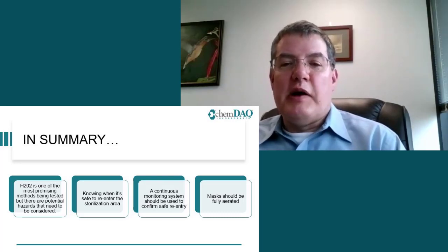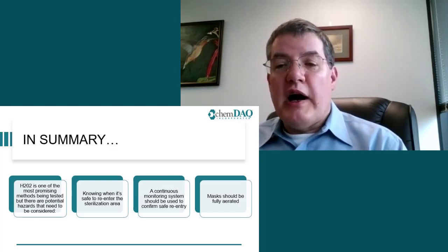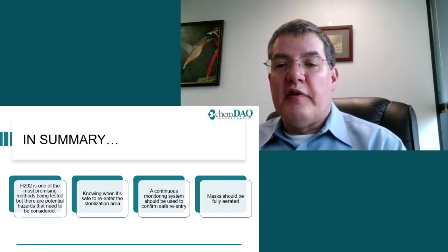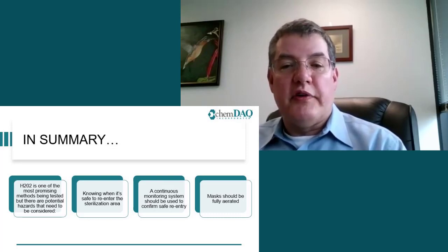Using hydrogen peroxide, however, poses risk for both methods, but especially for room disinfection. Hydrogen peroxide is, of course, toxic and has no smell. How does one know when it is safe to re-enter a room? The answer is to use a portable gas monitor for hydrogen peroxide. Similarly, residual hydrogen peroxide in the mask present a risk of exposure to hydrogen peroxide to the next wearer, and the combined outgassing from large numbers of masks presents a risk to personnel reprocessing the mask. And again, the gas monitor provides the simplest solution using the protocols that we have suggested.